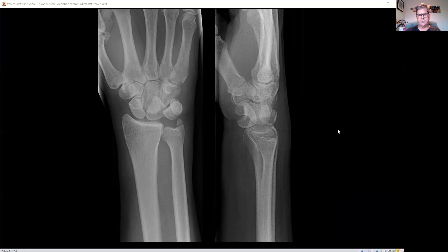What do you notice about it? That doesn't look right. The carpal bones should have a little gap between them, but here they're on top of each other. This is called the crowded carpus view. And on the lateral, it doesn't seem right either — it's all crowded. What you can see is the lunate. Lunate means half moon — and it's popped out. It usually sits here, but it's popped up like that, squeezed like a pip. This is a lunate dislocation.